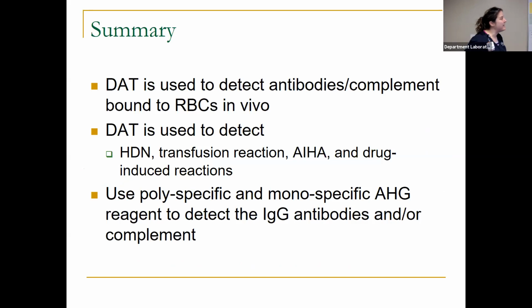All right, so that's the DAT. Your takeaways, number one, your DAT is used to detect antibody or complement that has attached to patient red cells in vivo. Okay, it has happened in the body. And the reagent used for the DAT is your anti-human globulin.